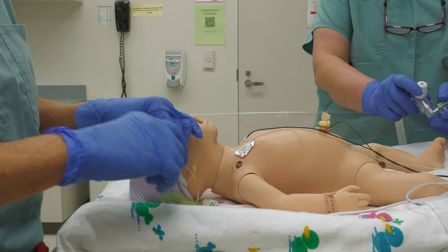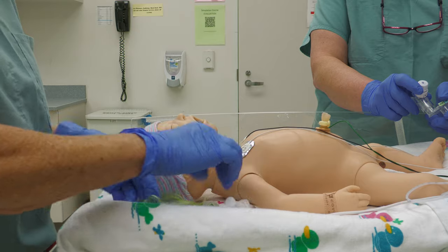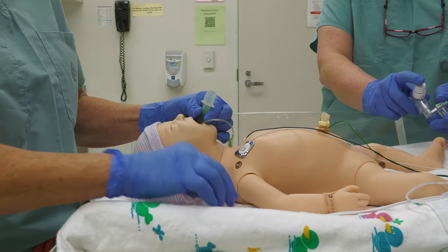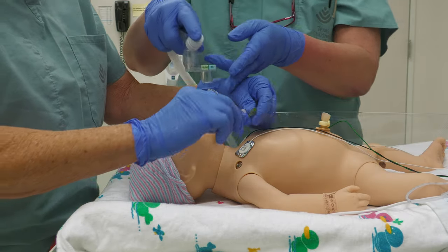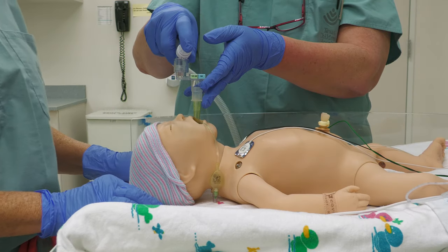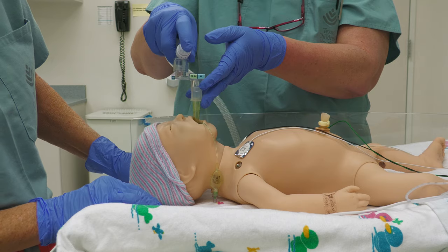Then, hold the endotracheal tube against the hard palate and remove the blade. To place an LMA, deflate the cuff around the mask and remove the syringe. Open the baby's mouth and press the tip against the hard palate. Advance the LMA inward with a circular motion. Stop advancing when you feel resistance, then inflate the cuff to seal the mask over the airway. Initiate PPV and check for CO2 detection as you would for an endotracheal tube.